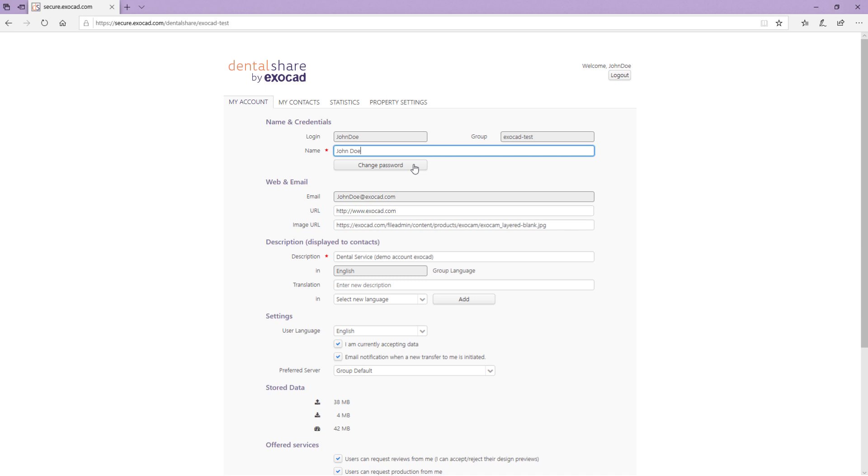You can select to generate a random password which will be sent to you via email or set a password of your choice. You cannot change the email address as it is derived from your registration.